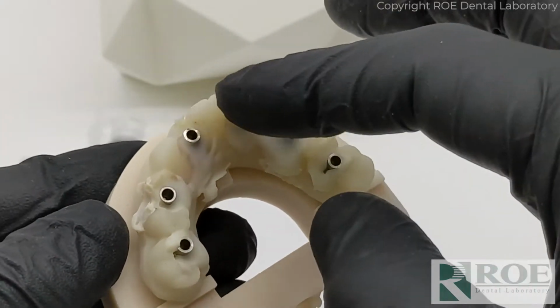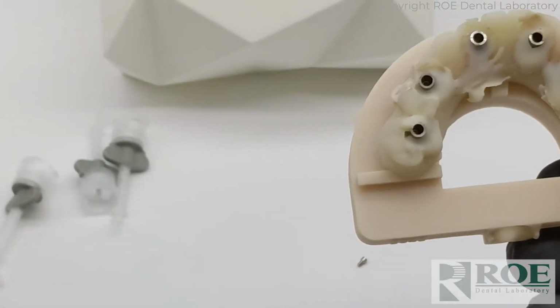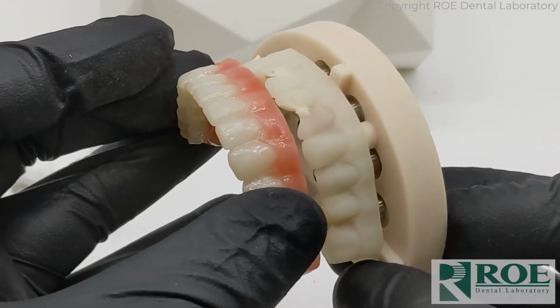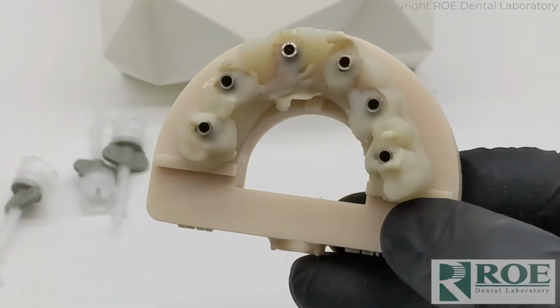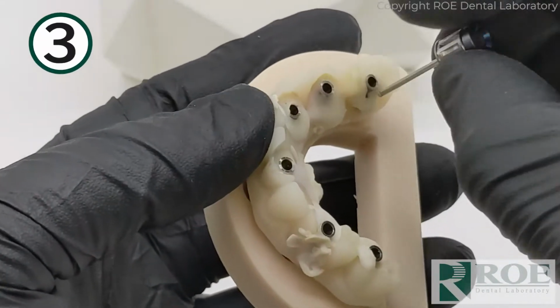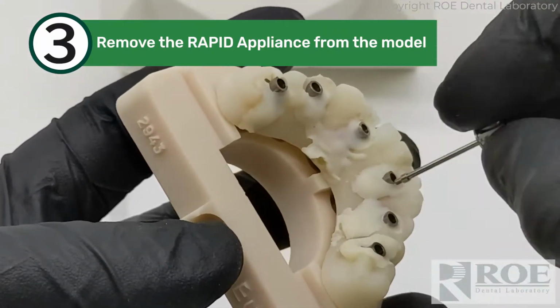The next step will be to take this prosthetic off of the model, because we made a model, and then we will transfer this take-home prosthetic to the model and pick it up. Basically an extra oral conversion. At this point, this prosthetic is just screw retained. So just take all the screws out.